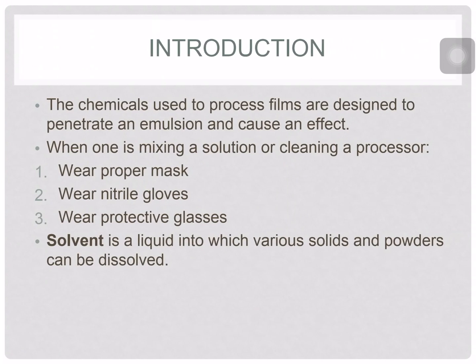Okay, so sabi ko nga kanina, our chemicals used for processing is sometimes or usually in a form of powder. So, ang film ba, pag i-develop natin, isasawsaw mo lang ba siya sa powder? Syempre, hindi. We have to mix our solutions with the use of a solvent. So, ano ba yung solvent? Solvent is a liquid into which various solids and powders can be dissolved. So, the chemical in powder form should be dissolved in our universal solvent, which is the water.